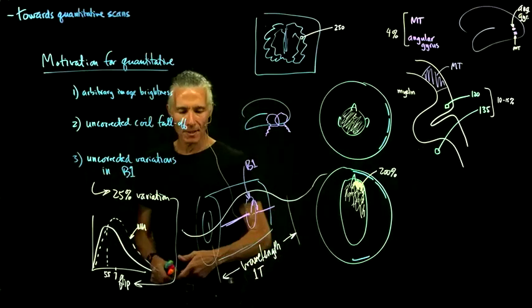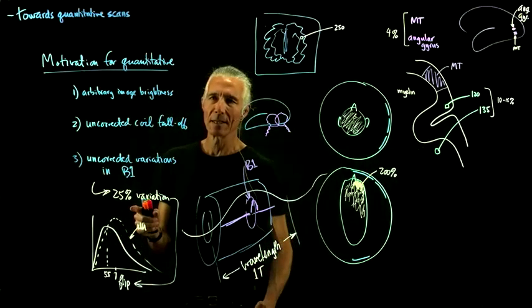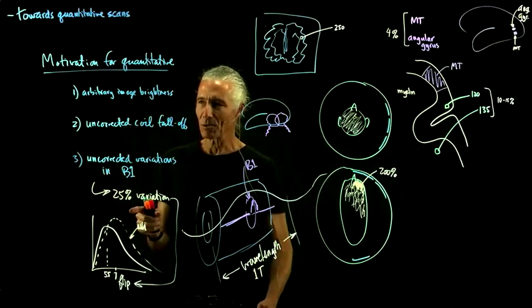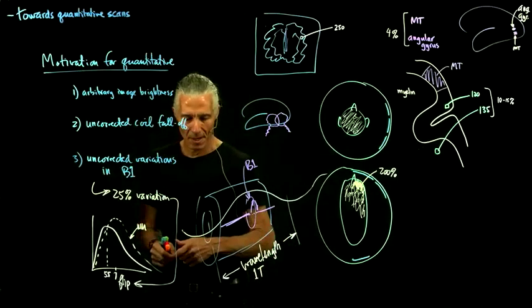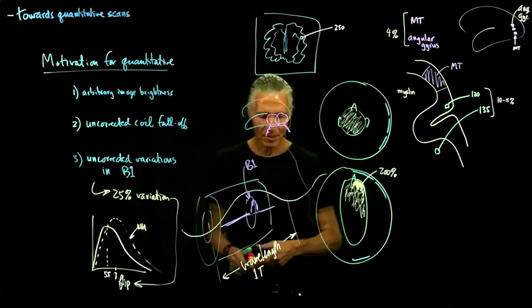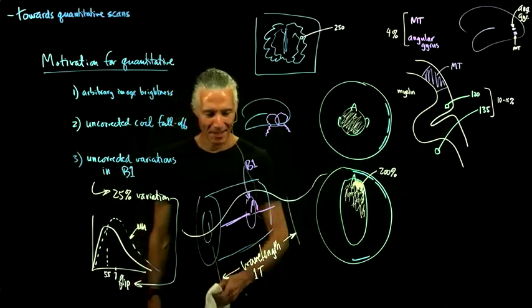So that's another problem. How do we fix this? I'll talk about that next. There are ways to fix this one too, to compensate for the fact that we haven't done the same flip angle throughout the entire head. So that's pretty much the motivation.